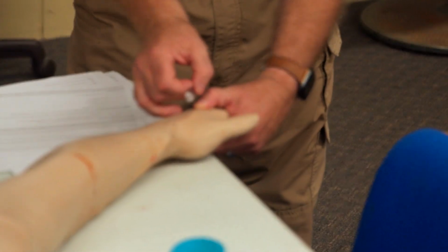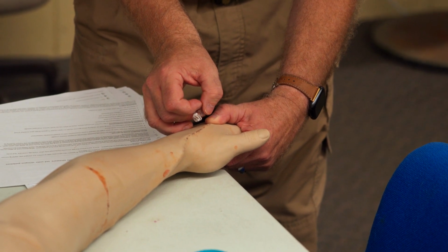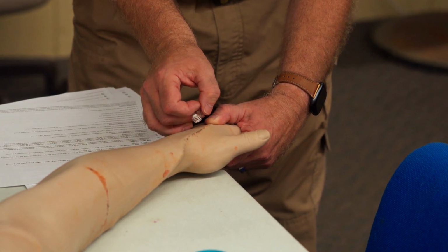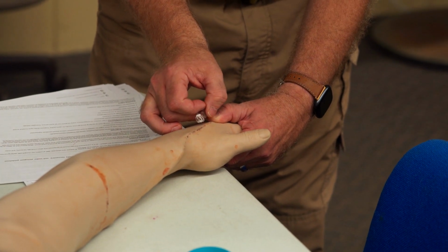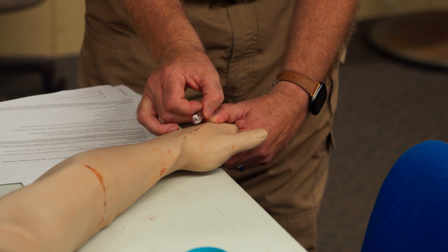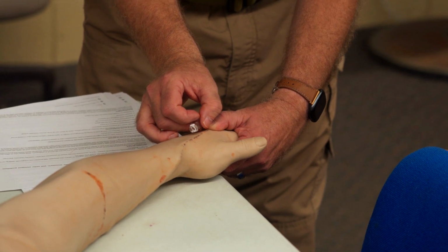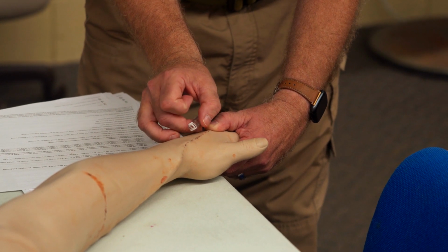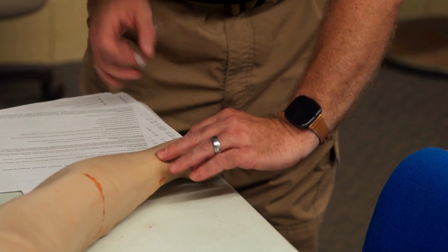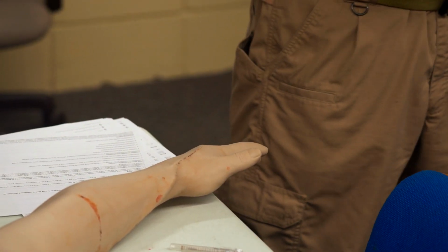What I see new IV folks doing is being very tentative and going super slow, slicing into the skin and then finally into the vein. I'm going, God, that's gotta hurt that poor patient. So for me, I'm going through the skin and hopefully into the vein. If I don't get flash right away, or if I don't feel that slight pop when I go in, I'll go just a little more. Now I got it, flatten it slightly, finish up by pushing in the catheter, then retract. But either on top or the side, it's a preference, and you get used to it and figure out which one works for you.